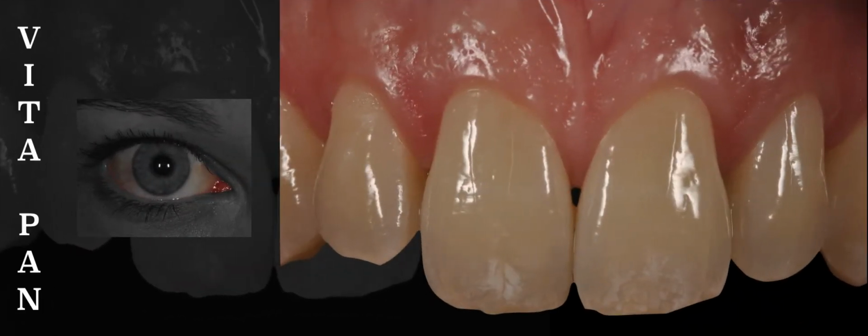Once we understand the shade tab, let me explain the way I use the tab clinically and give you the reason why. We are going to divide this by steps. So step 1, look at the teeth or tooth you need to match. This should take no more than 5 to 10 seconds. The longer the time, the more chances for error.